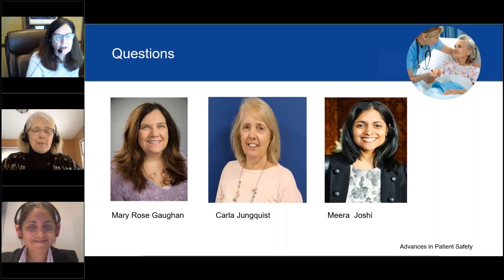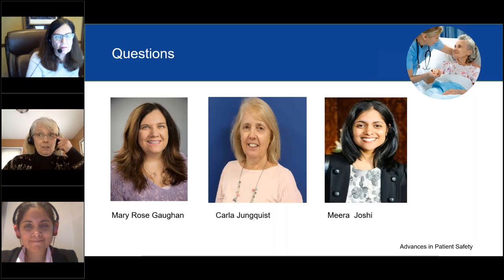Okay. And Mary Rose, let me talk about one of the studies that you and I actually participated in, in the PACU. With the monitors, if the leads aren't sticking, you're going to get a lot more alarms. So it's best to do a clipping. I don't know about shaving, shaving is sort of passé at this point. But taking the scissors and cutting the longer hair off is really important, especially for the minute ventilation monitor that we used. Those leads were bigger and they were really sensitive to hair. So if it's significant hair, we would just take a pair of scissors and clip it off.